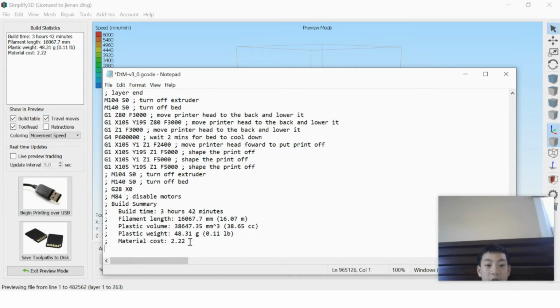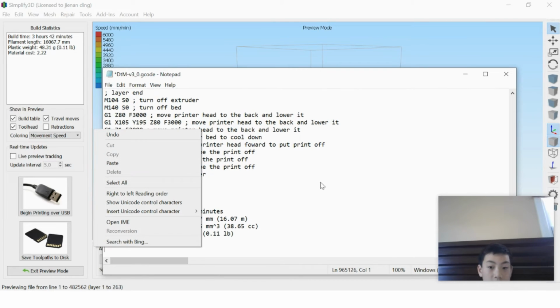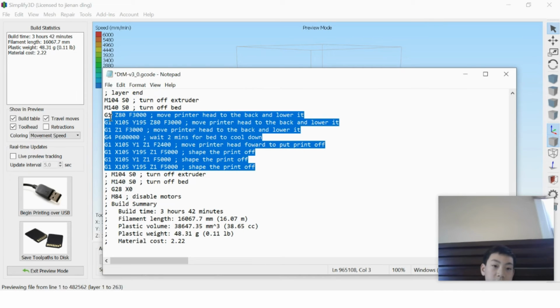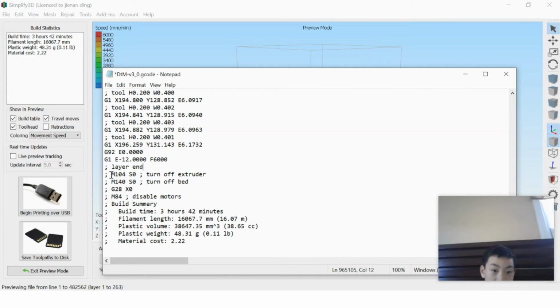Now, let's say I only have to do 2 prints. Then I won't need it to push the shape off at the end. So I'll just delete all of this. And since these aren't comments anymore, I actually want it to turn off the bed and extruder. I just delete the semicolon in front. And it becomes good.